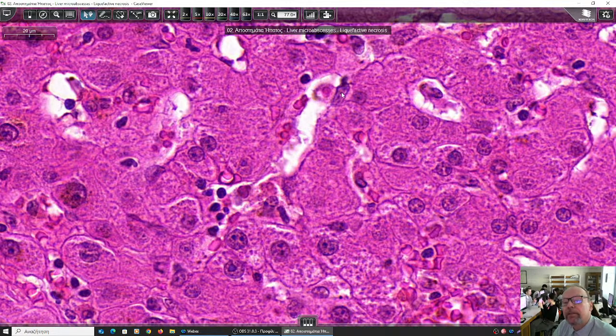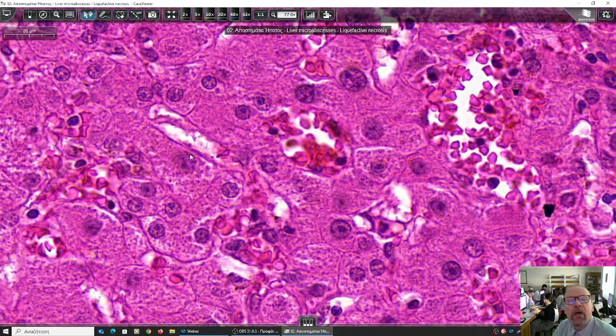I think this might be a nucleus of a hepatocyte. This perhaps here. Something like that, because they're somehow flattened cells. Yes. I won't ask you about the Kupffer cells. I'll ask you about the neutrophils and the microabscesses, and whether they are connected with bile ducts, or are they throughout the liver parenchyma? That's all.